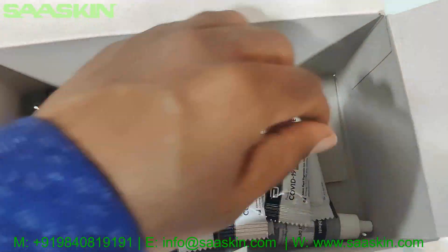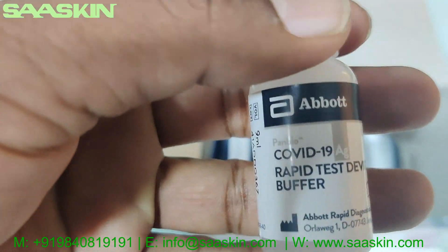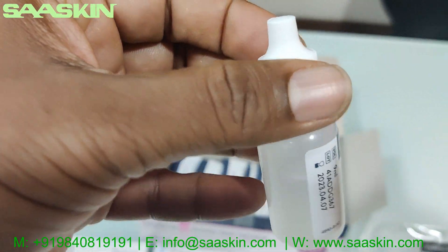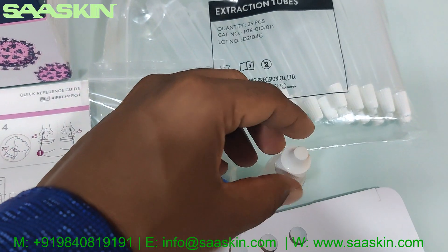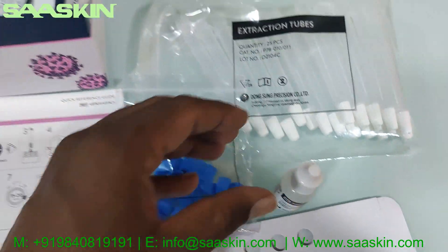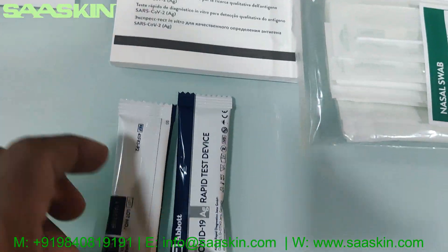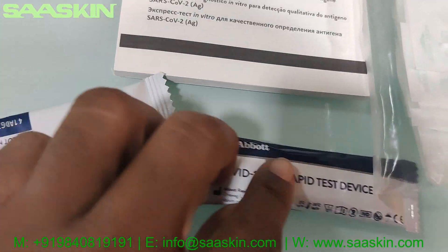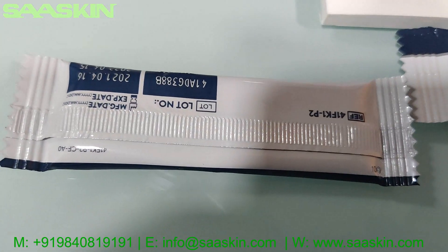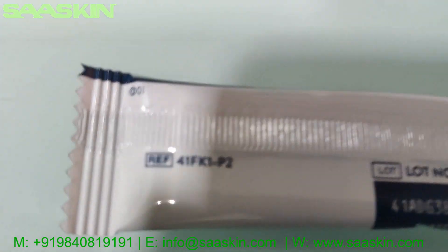You can see the 25 test cassettes here. Let me pull out the buffer liquid — this is the extraction buffer liquid that is used for the test kit. It's a 9 ml liquid bottle. The other side of the test cassettes shows the expiry date and part number.